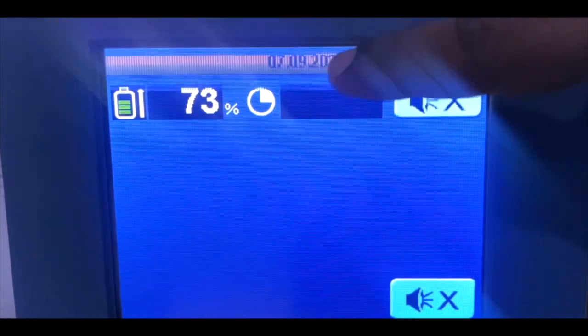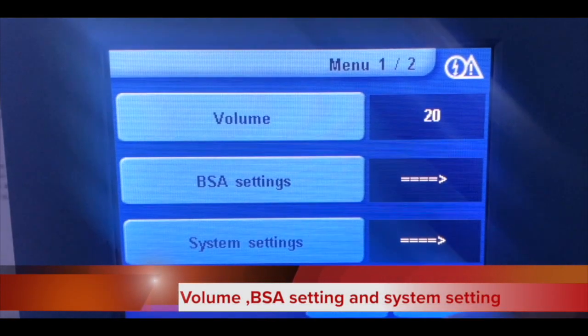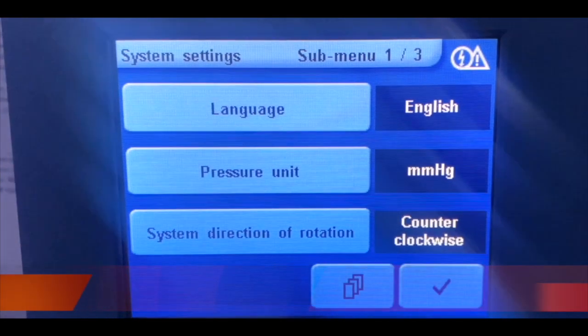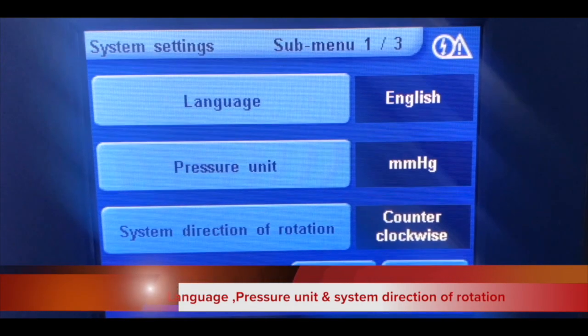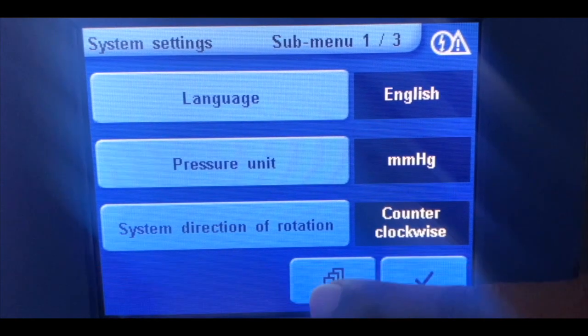You have to click on the system setting option. Then you will get the option of language, pressure unit, and system direction on the first page.